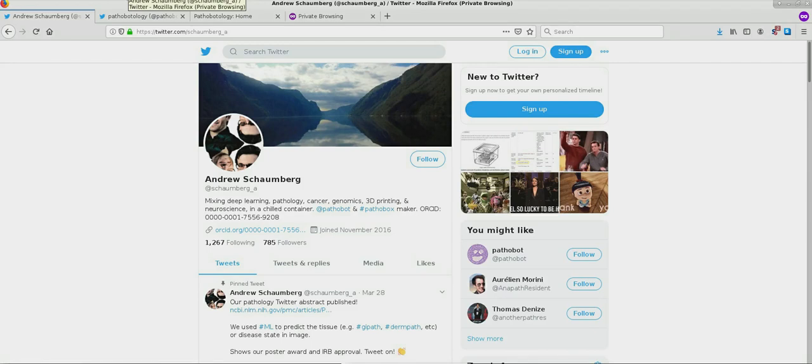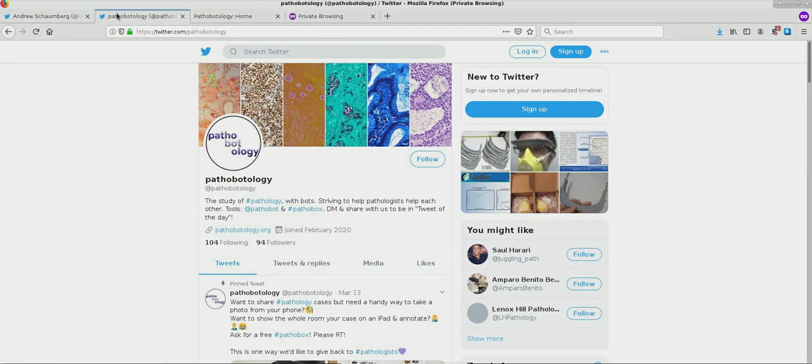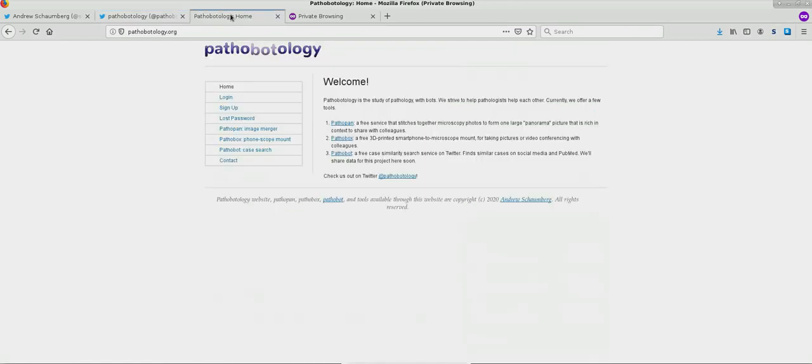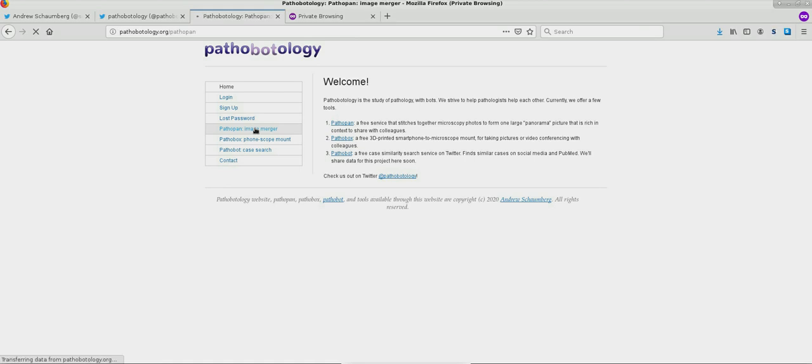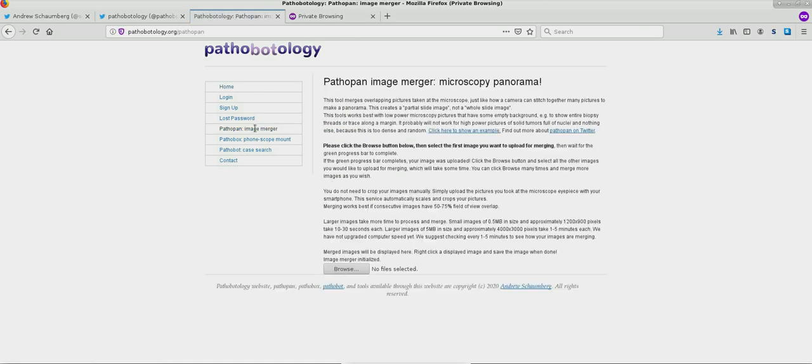Hello, my name is Andrew Schoenberg. I'd like to talk to you about a pathology tool called PathoPan. PathoPan is a tool to merge multiple pathology photos together.